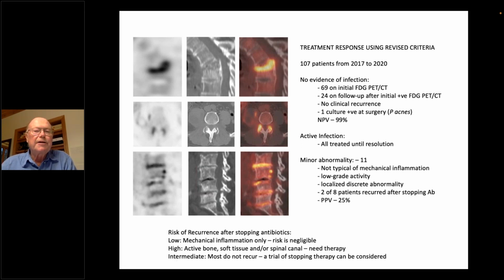Just for interest, here's typical mechanically induced inflammation in destroyed facet joints. And here's another case who had pyogenic spine infection at L2-3, and here we see typical mechanical inflammation. Less severe mechanical inflammation is seen at degenerative disc disease at lower levels, but there are also 2 small discrete epidural foci.